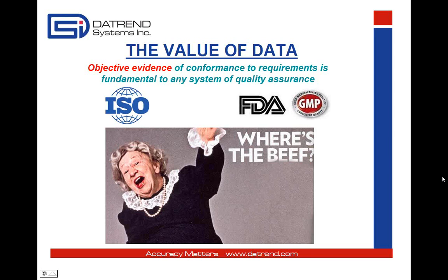So for some hospitals that are accredited by agencies that follow ISO, those hospitals will need to prove objective evidence of their performance. Some agencies, however, don't follow an ISO standard. Regardless of who accredits a hospital, the federal regulation says maintenance procedures must be strictly followed. A service record that shows completion of each maintenance step and measurements that fall within limits defined by a manufacturer can't be argued with. It's hard evidence your maintenance program really works, and it results in the same or better patient safety than if a manufacturer had done that service for you using their procedures.